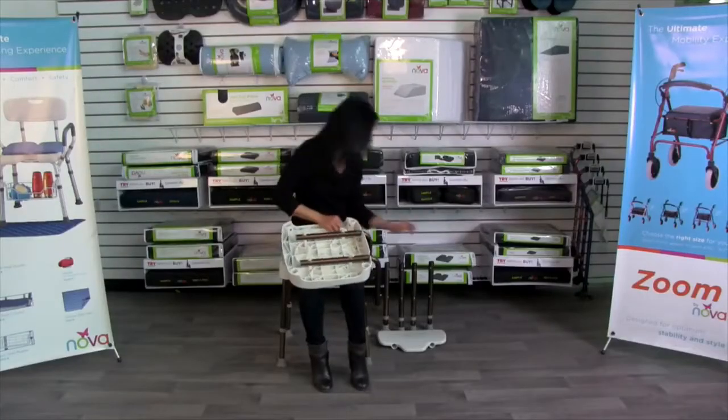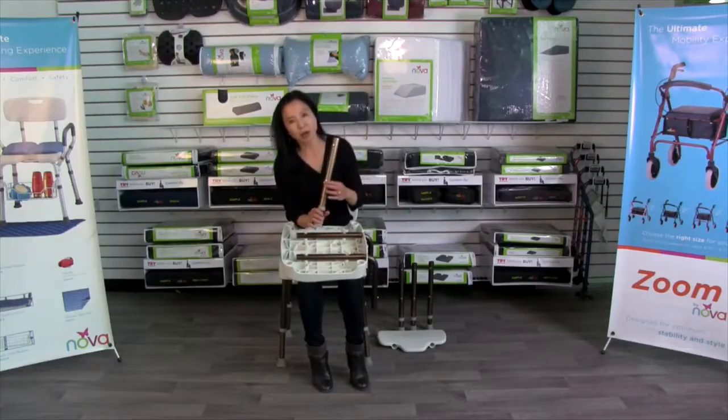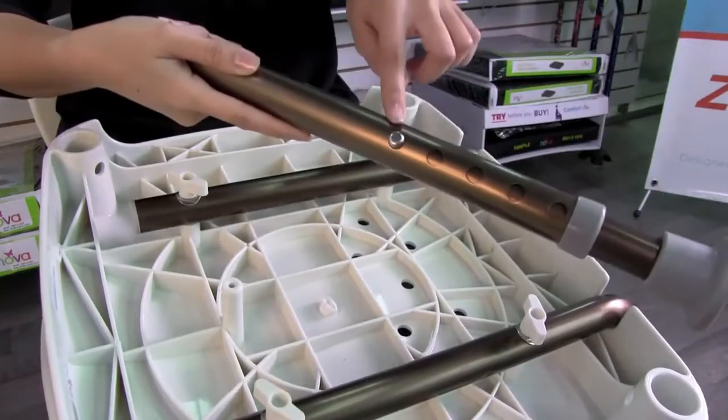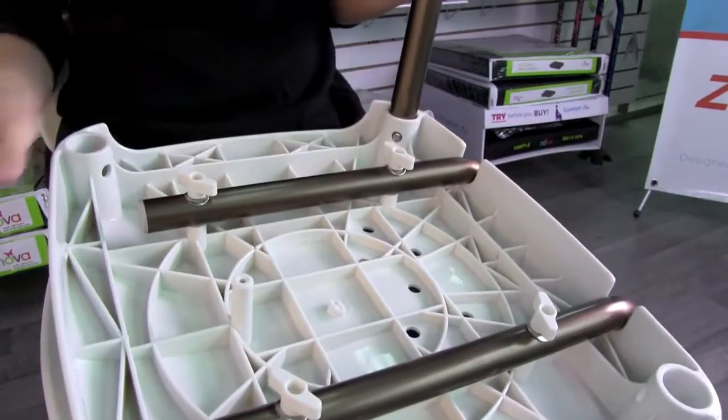Now you're going to insert the legs. Each leg has two push button areas. The lower push button allows you to adjust the legs to your desired height after assembly — make sure all four legs are at the exact same height. The top button allows you to insert the legs; simply push the button and make sure it comes out on the hole insert.